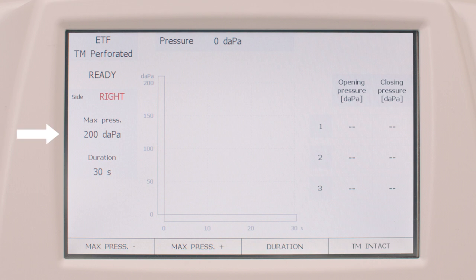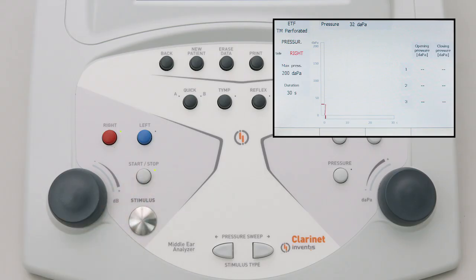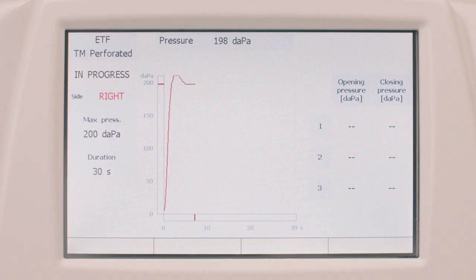The user can select the pressure value to be set in the ear canal, choosing values between minus 600 decapascals and 400 decapascals. Here you can also start the exam by pressing the start button on the keyboard or the relative buttons on the control box. Results are calculated automatically and displayed on the right-hand side of the window. The three pairs of numbers are the initial and final pressure values recorded during significant pressure variations. These pairs of values can therefore identify the pressures at which the Eustachian tube opens, indicated by the label O, and closes, indicated by the label C.